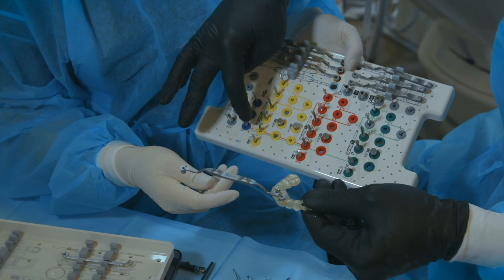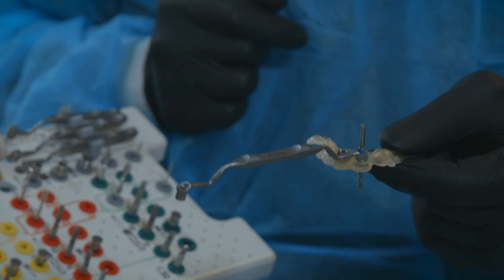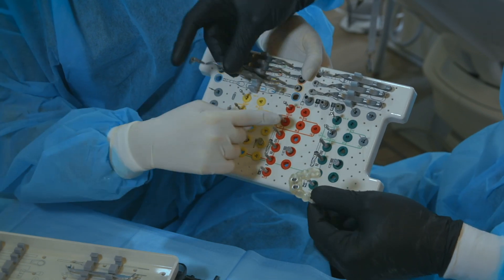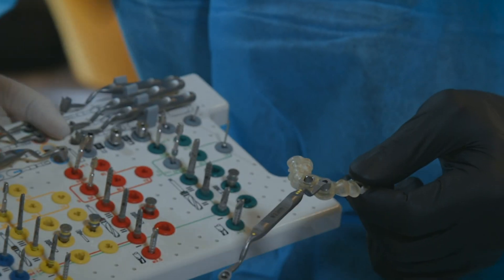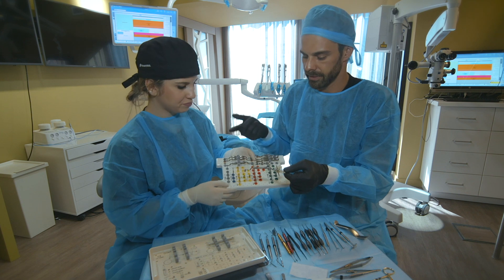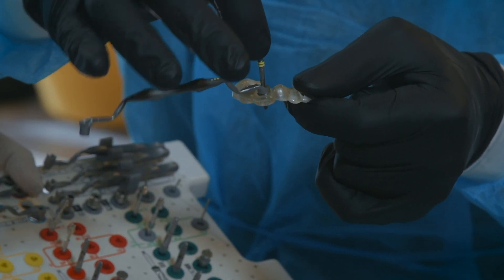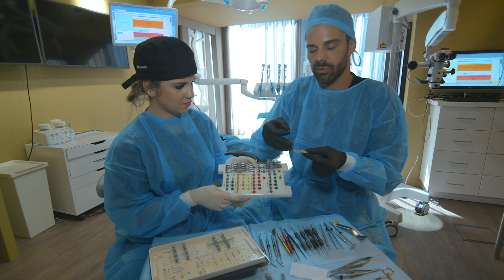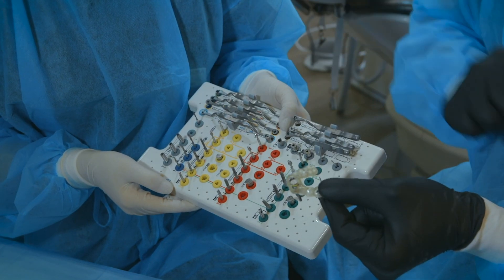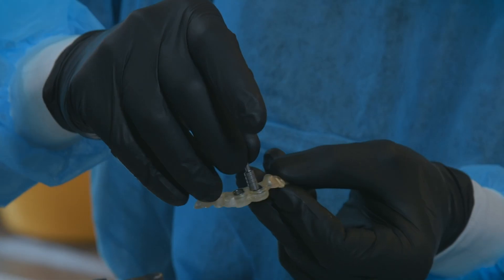We are using the three circles. In this case, we'll start with this drill — so you go for three lines. When the lab tells us to use three circles, we always choose this side of the drivers. And when it says three lines, we always choose these drills — the highest ones. Here you have the second drill, and the final one, because we are going to place a 3.3. Please, only start drilling when you are fully seated — don't start drilling before. If you are doing two implants or more, for example a full arch, you have these fixation pins that can fix the guide. And after this, you have the implant driver.